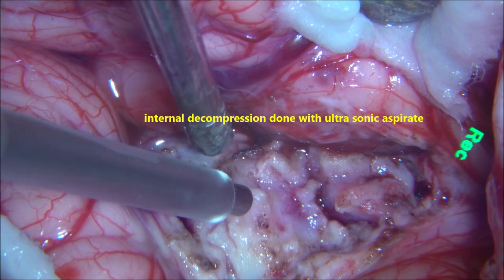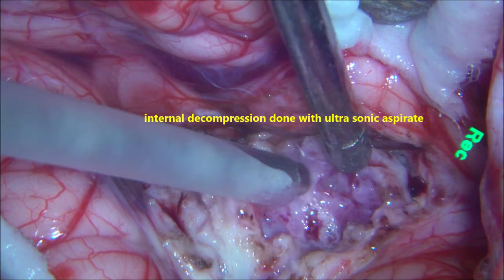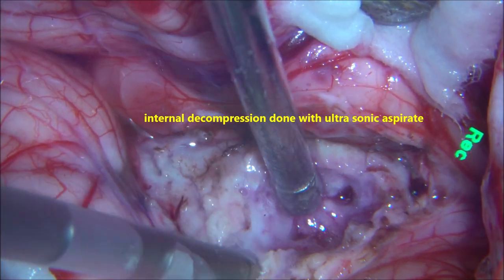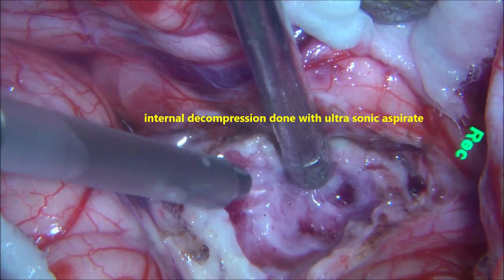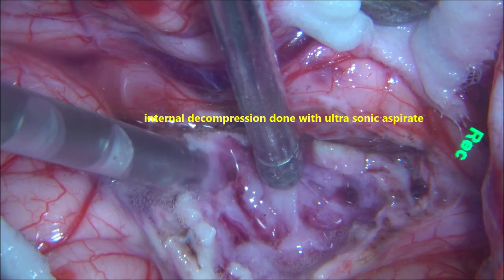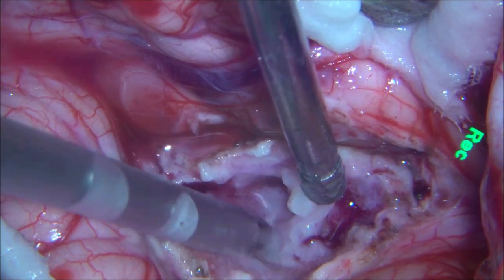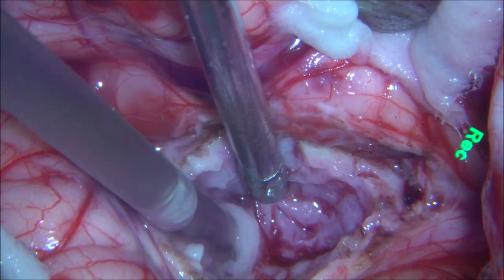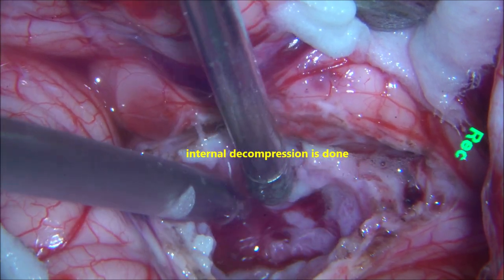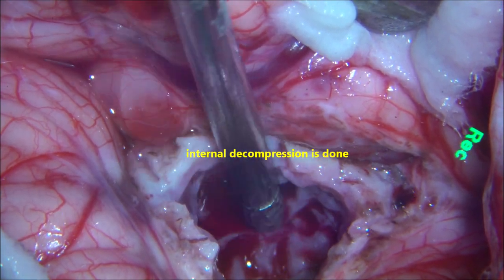These are the blood vessels supplying the tumour. With the ultrasonic surgical aspirator, rapid internal decompression is done — the tumour comes into the aspirator quite well. The lower lobe of the tumour is decompressed. Internal decompression is done, the tumour is reduced in size, and once you do that, the tumour capsule falls inward and easily starts getting separated from the surrounding normal cerebellum.